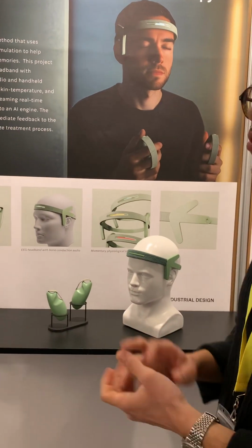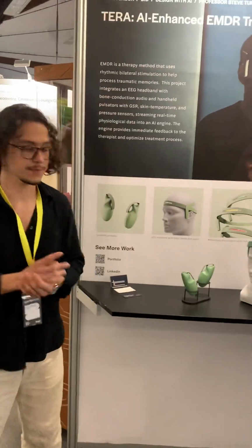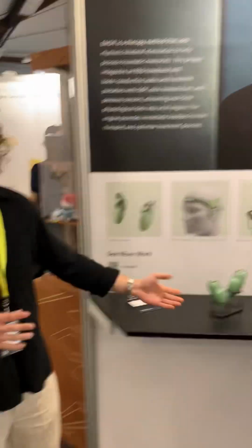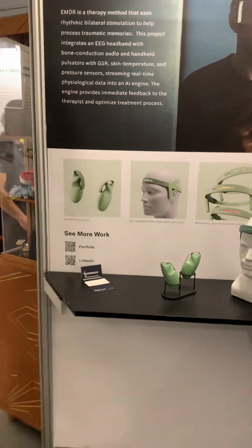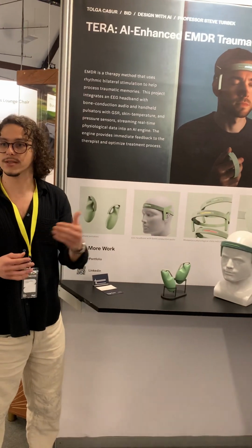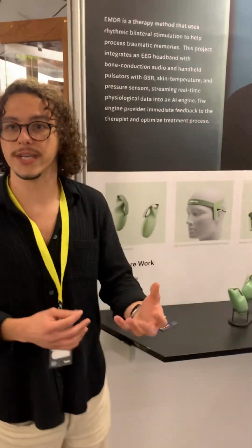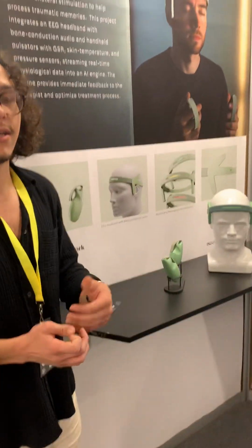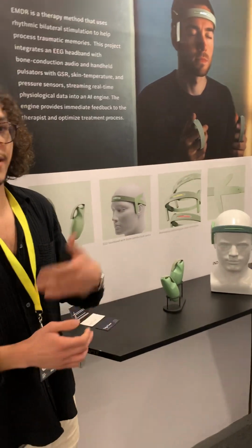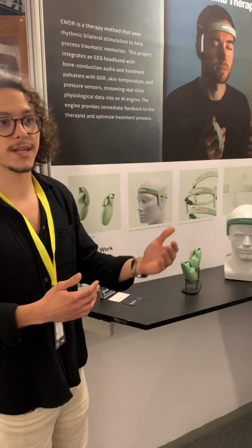So I designed two different products: one is hand pulsators and the other is headbands. Their main purpose is to gather physiological data from the patient during the treatment process, so that the doctor has more concrete scientific data that will allow them to make the treatment process more efficient and get better results.